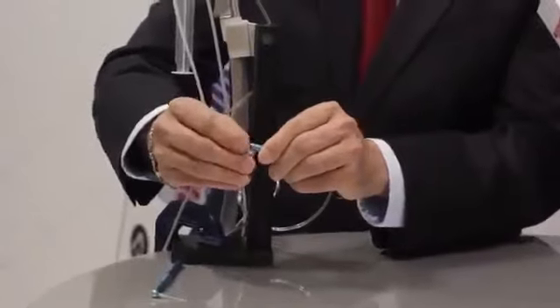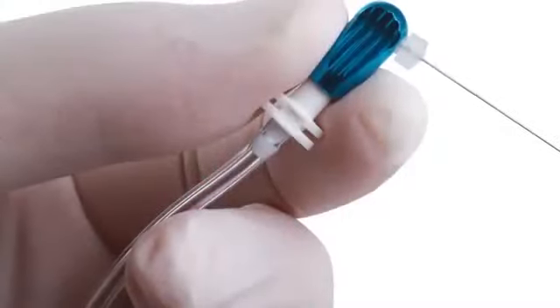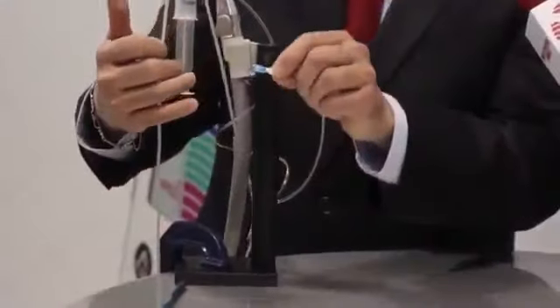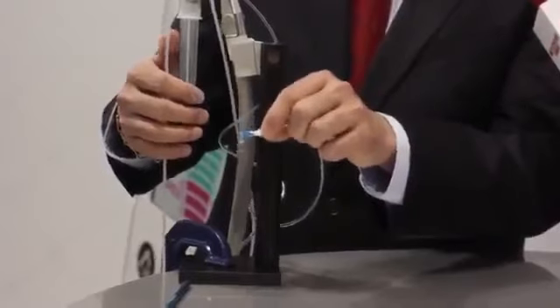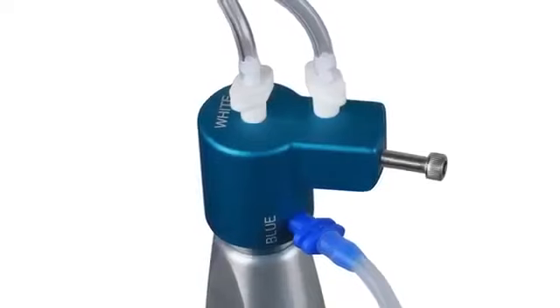Now, the third major component is the EndoVac micro cannula, and that is connected through the handpiece, and believe it or not, there's 12 micro holes at the bottom of this. What the dentist does is put it at the very end of the root canal, and what that does is takes irrigant from the chamber, brings it down the root canal system into the 12 holes and up again into the office high-vac.